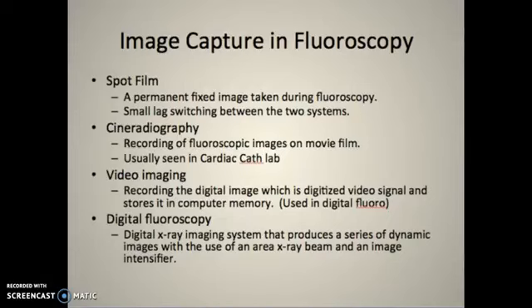With Cine, it records the fluoro images like a movie. It's usually done in the cardiac cath lab while they're injecting the heart. Or if we're doing any kind of runoff, they can follow it all the way down and it records.